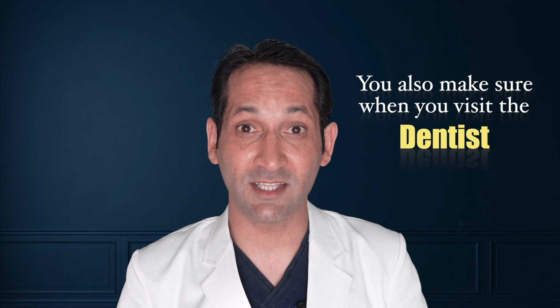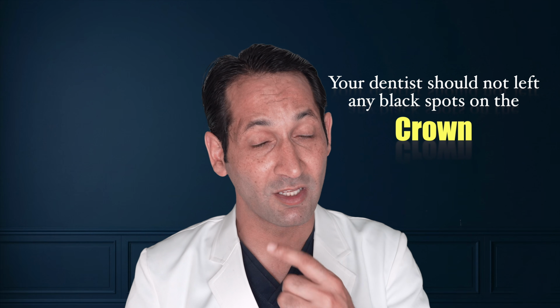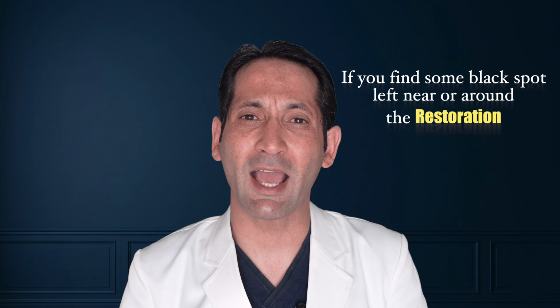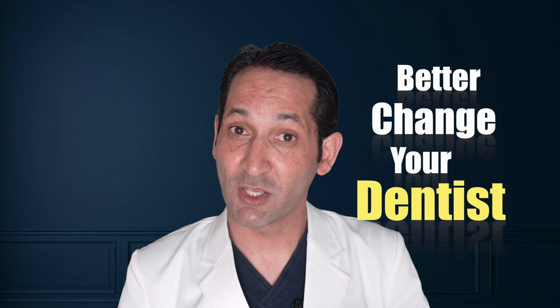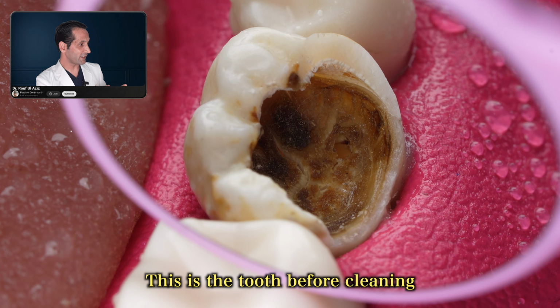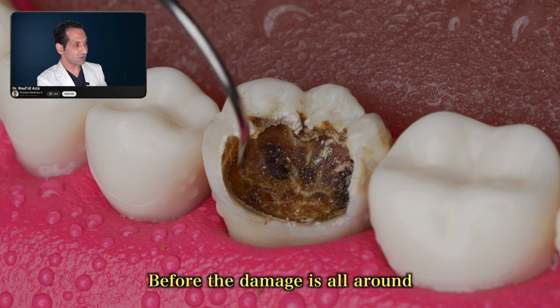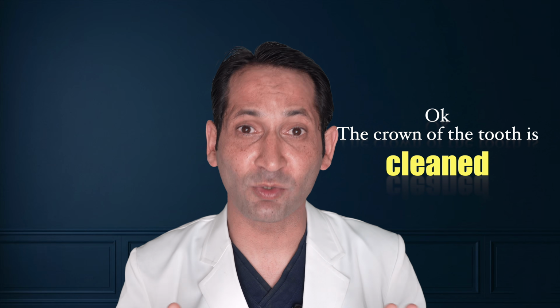You also make sure when you visit the dentist, your dentist should not leave any black spots on the crown during the restoration. You can have a look and see. If you find some black spot left near or around the restoration, you better change your dentist. Okay? Leave that part. After cleaning the cavity, the crown looks like this. This is the tooth before cleaning and right after cleaning. Before, the damage is all around and now only sound structure is left. Okay, the crown of the tooth is cleaned.